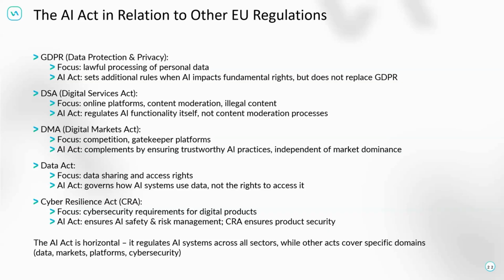So that's one of the big problems, since the AI Act has been built up very horizontal compared to the verticals we had in the past. The verticals would be easier to control and easier to watch out and look for, whilst the AI topic with the AI Act on the horizontal basis will have a lot of additional setups and requirements and parts needed.